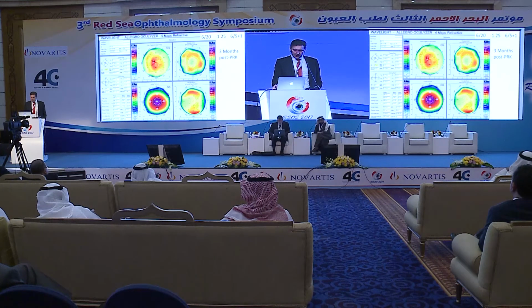So the first thing you do is you simply do the PTK. And as you do the PTK, you saw yesterday, as you're going down, you'll already start regularizing the cornea. And then as the second part, directly after, you do the topo-guided PRK. And this is how the patient looked 3 months following it.